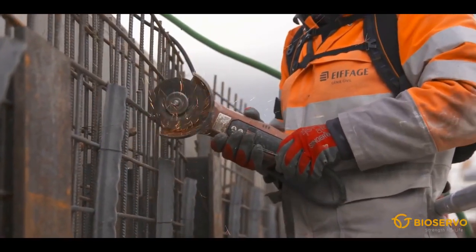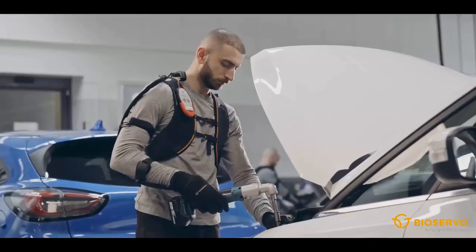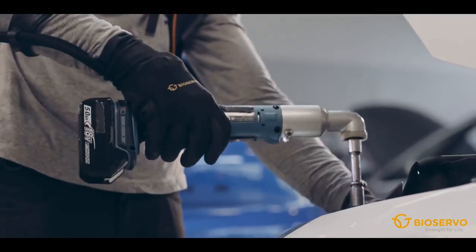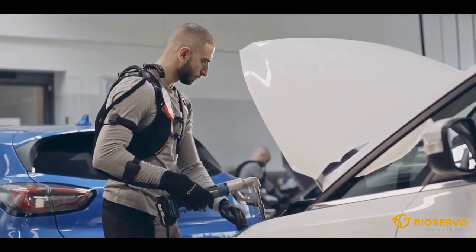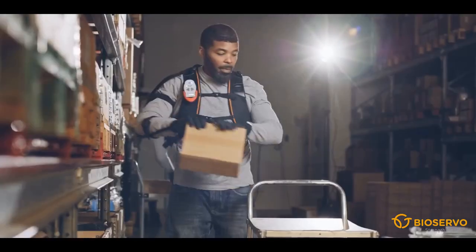Ironhand is the world's first active soft exoskeleton for the hand. It's built to keep workers strong, healthy and efficient, and strengthens the human grip, prevents strain injuries and decreases the need for sick leave.